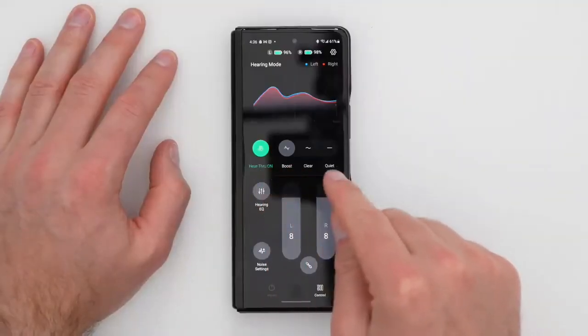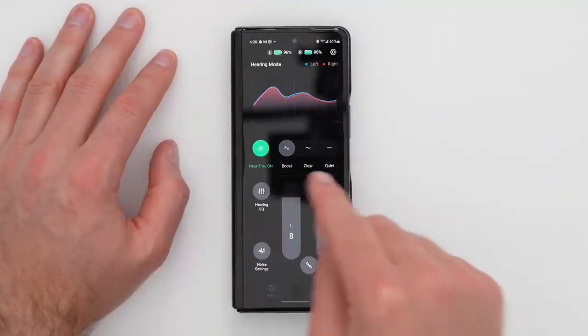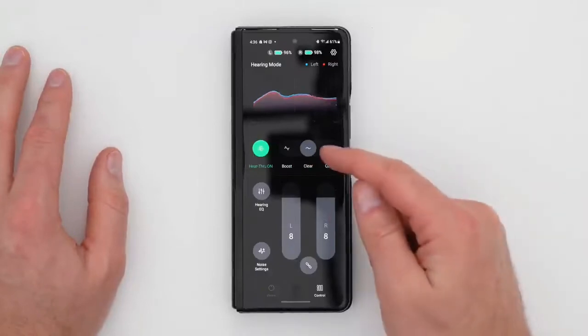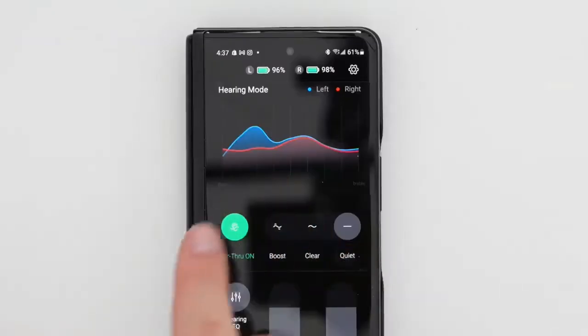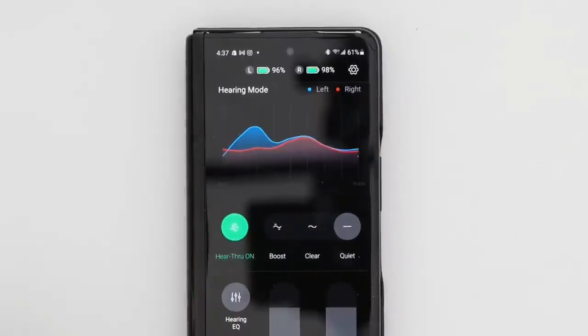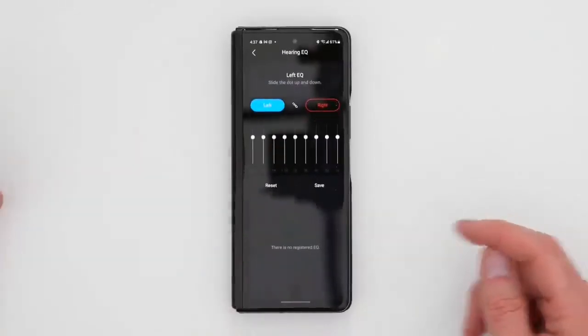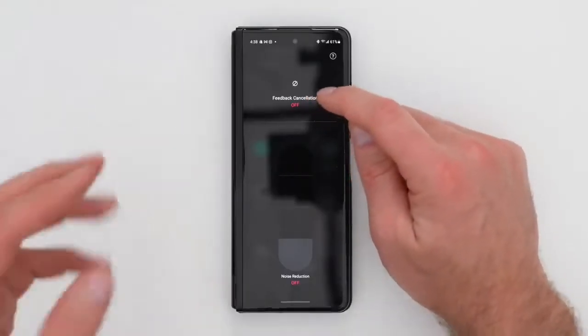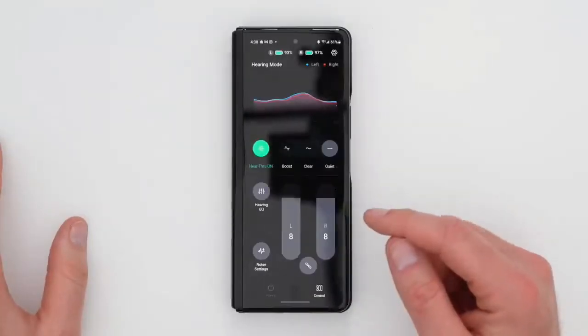Hear through is turned on, and here are my variety of settings for how I want it to behave. There are 3 presets: boost, clear, and quiet. You can see within the quiet setting, my left and right ear are being treated a little bit differently. I can also go into hearing EQ here and boost on the left or right, or I can link them. We have feedback cancellation because there's microphones right beside speakers. And we also have noise reduction.